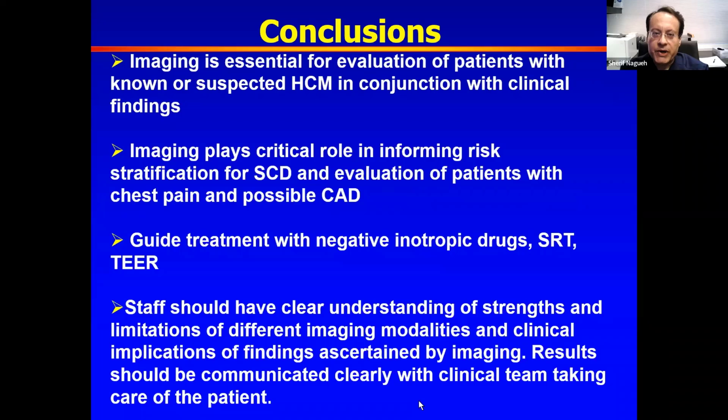We'll now look for questions. I see 3 questions. How do you perform one of them, squat to stand, while doing transthoracic? So the patient will do the squat to stand several times, and after they have done it several times, you will go for the image acquisition, as opposed to during when they are doing that.